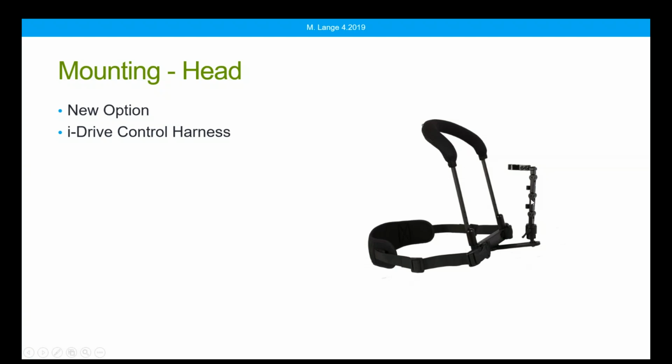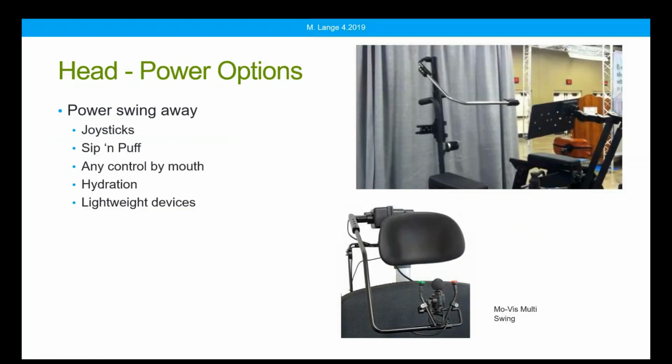And we have lots of adjustment depending on how many links you put here, and those can be adjusted quite readily by a tool or by this knob, this lever here. We can adjust some of the movement and place that joystick just where the client needs it. This will also support various outriggers if we needed to also place a mode switch, for example.